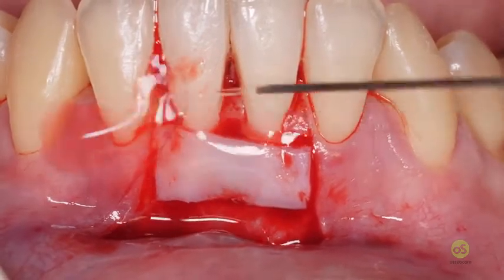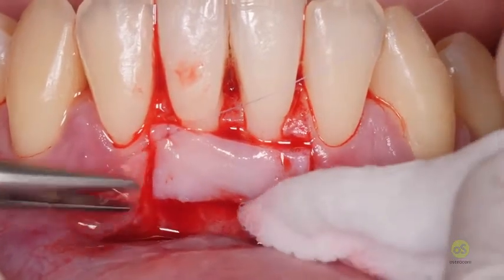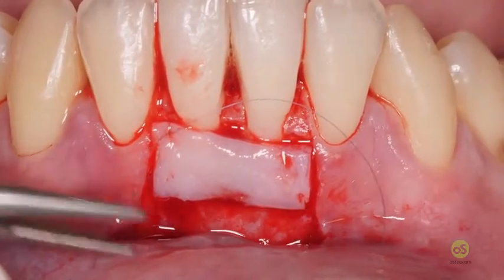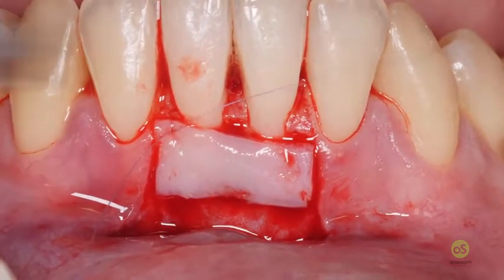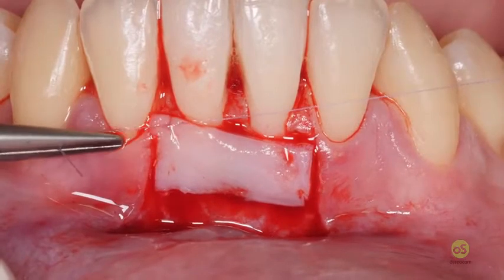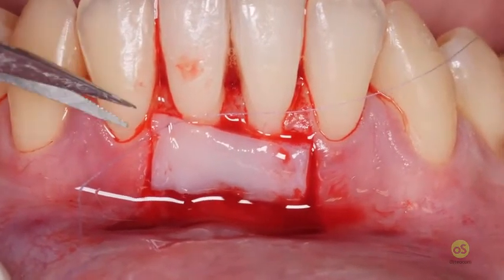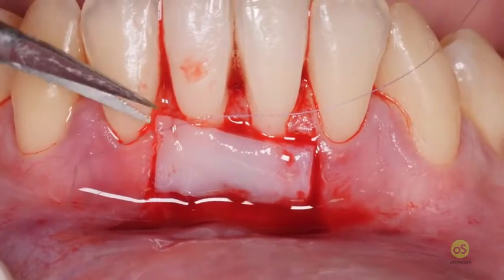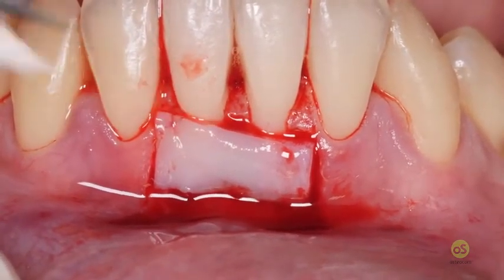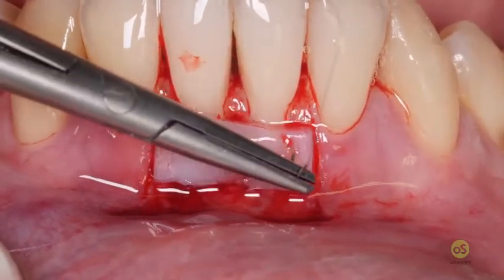The graft should be placed at the level of the cement enamel junction of the teeth, leaving the papilla, especially the horizontally desepithelialized portion, completely free for the surgical papilla of the coronally advanced flap. Never suture the papilla that is weaker first.